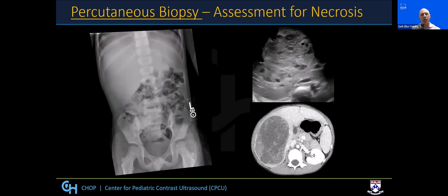In addition to lesion identification, component targeting is a critical use for contrast-enhanced ultrasound. So this was a 10-year-old male who presented with a right hepatic mass with a differential of hepatoblastoma, hepatocellular carcinoma, and undifferentiated sarcoma. On radiograph, you can see the enlargement of the right hepatic contour. On ultrasound and post-contrast axial CT, you can see the heterogeneity of the lesion with patchy peripheral enhancement.